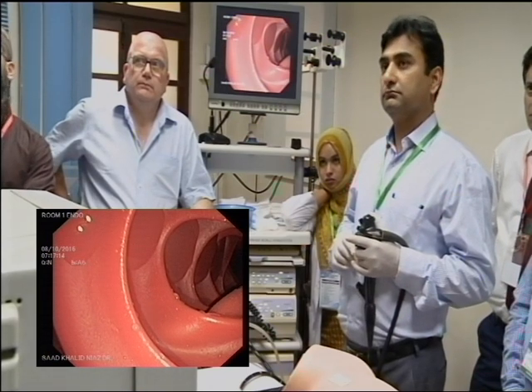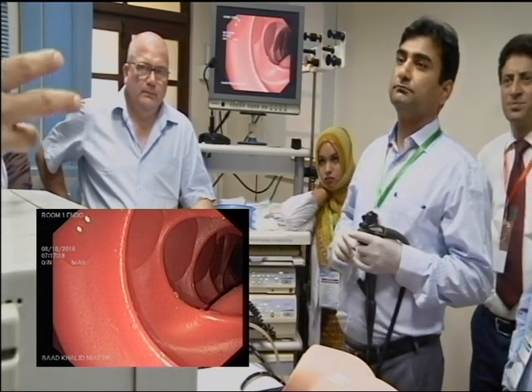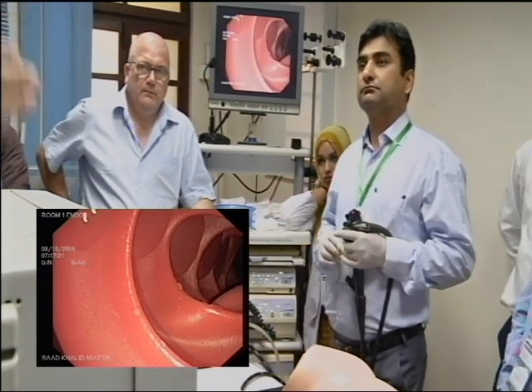From the pressure, you can see the lumen. Right. Observe, think, look at your options. Try in a sequential manner.